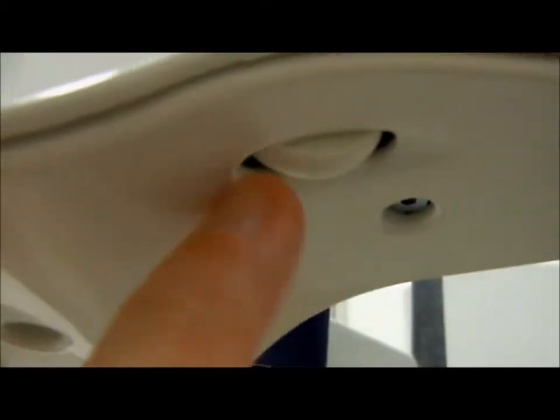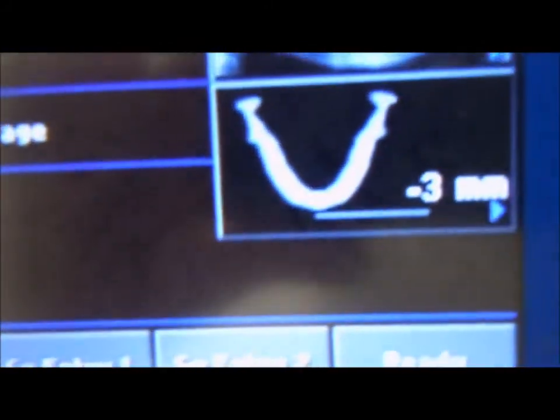Here's the Ball Phantom that we have set up. It just slides in and out like so. Underneath, this little roller button is where we select the patient positioning for the laser light, as you can see here. On the display it's negative 3. We want this laser in line with this black line here.